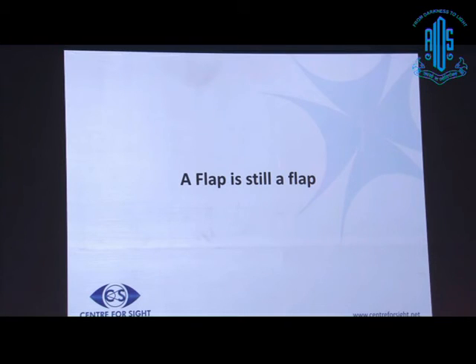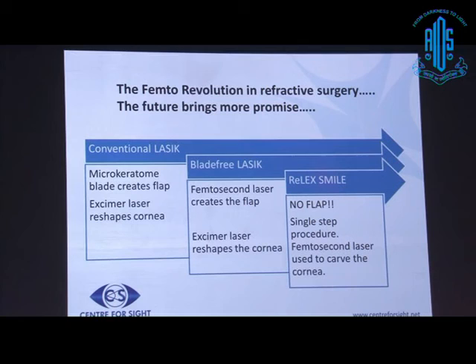All said, the femtosecond laser, though a master flap creator, a flap still remains a flap, and the next leap really came with the blade-free, flap-free procedure, which Dr. Rupal will take us through.